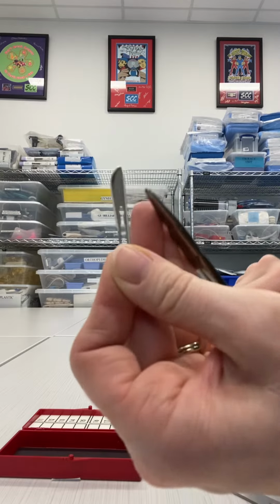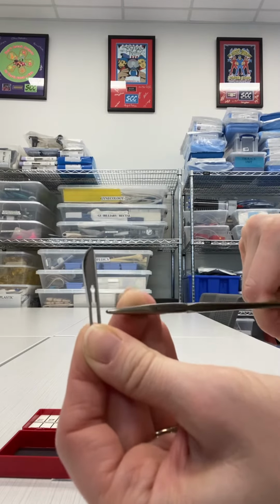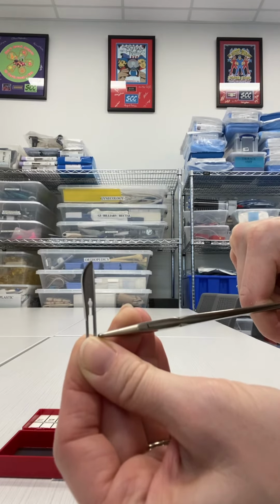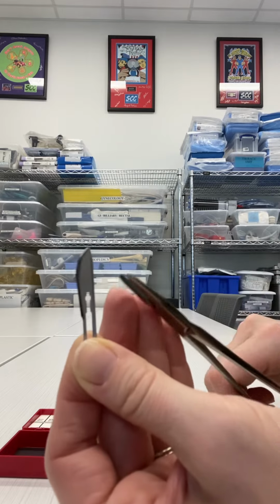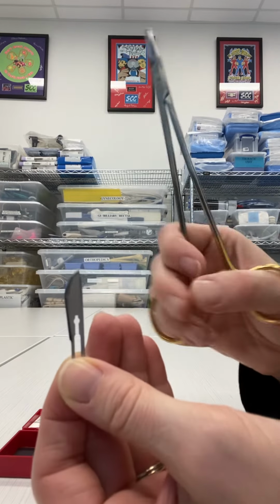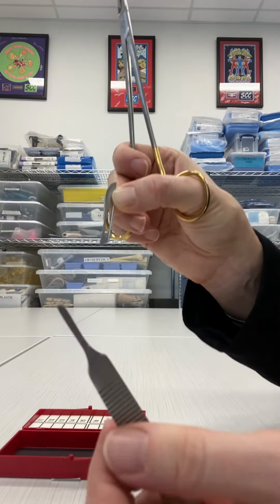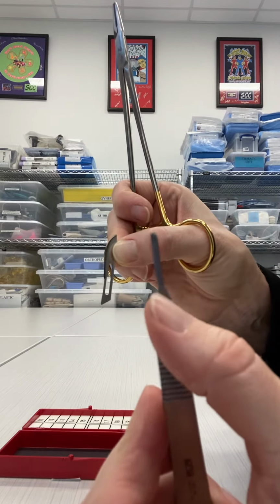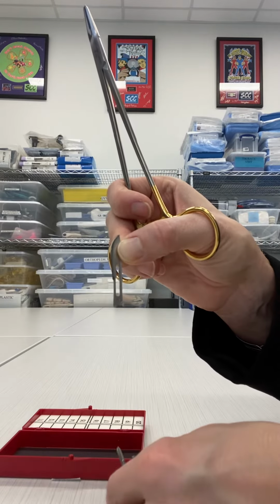So as you take a look at this blade, you can see the cutting edge is just on this side and stops about here. So when I hold on to this blade to reposition and attach the needle holder, I touch it below the cutting edge. I need to make sure the angle at the bottom of the blade is the same as the angle here on the handle. So I make sure that those are lined up the same.